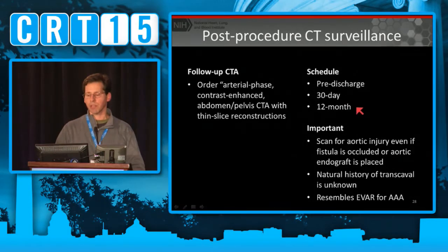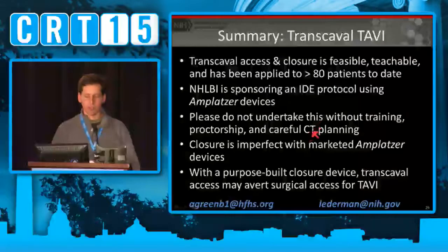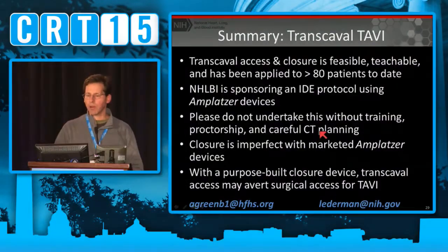Afterwards, they should be surveilled as are patients after EVAR with an arterial phase CT angiogram, both at pre-discharge, a month later, after a year. And to summarize, thanks for giving me a little extra time, so far there are about 80 patients that have been treated at about 14 medical centers in the last year and a half. I think we've learned that the technique is feasible, that it can be taught, and it's amazing that it works.